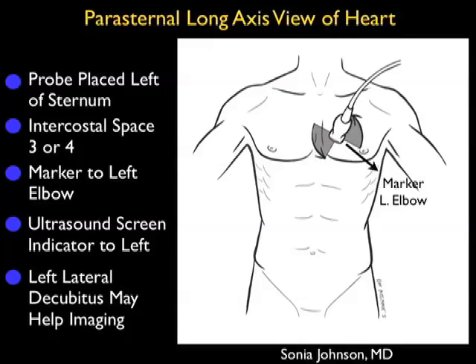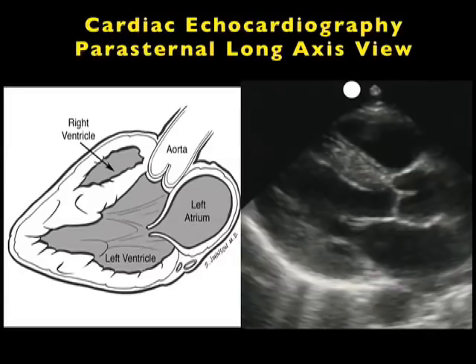Occasionally it can be somewhat difficult to get a good view of the heart from this plane, and moving the patient into the left lateral decubitus position can sometimes help imaging from the parasternal long axis plane of the heart. So now let's take a look at the images that we'll obtain by performing the parasternal long axis view of the heart.